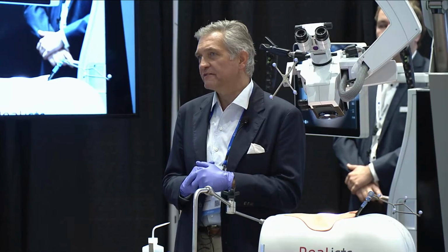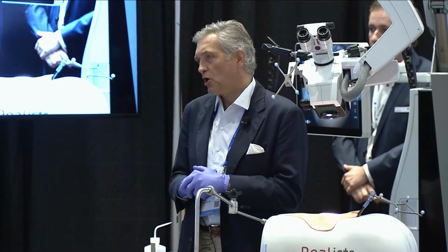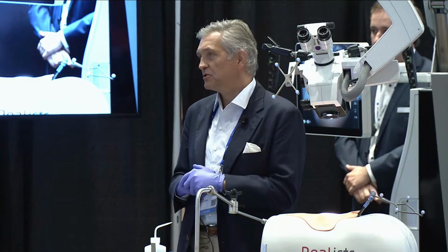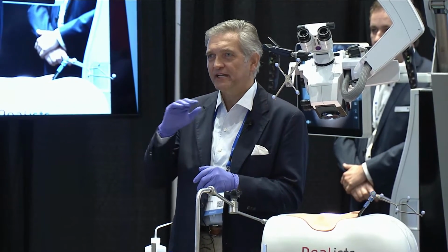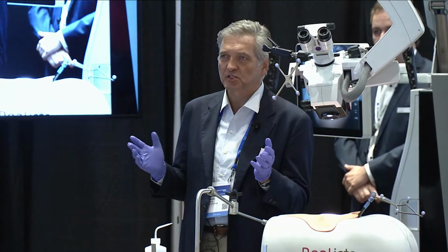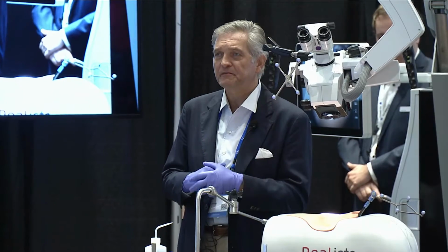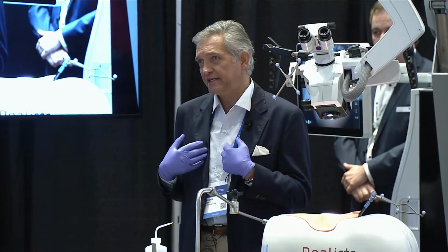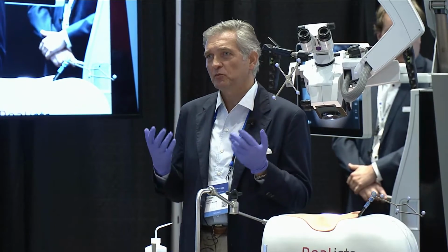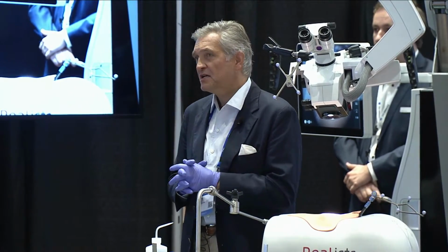So really all of us, we're 5 spine surgeons now in our group at Cornell, all navigate. So for us, the threshold to navigate a case is very low, simply because we all think that it helps us with workflow, precision, safety, and it eliminates fluoroscopy. You don't have to wear lead, for example, and once you get used to it, there are so many advantages to using navigation.